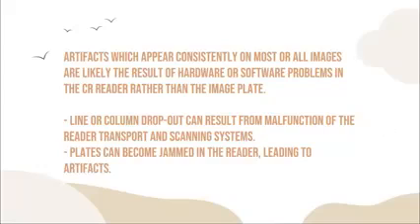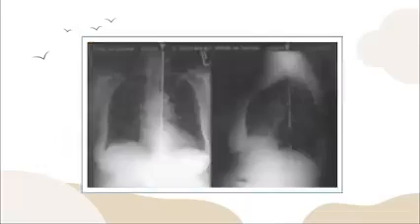Artifacts produced by dust can be corrected easily with proper cleaning unless the dust is internal to the optics of a CR system. Yun, professional help is advised. So, malimpyuhan siya kung sa outer areas. Pero kung naa siya sa mga inner areas sa inyong scanner, okay, professional help should be acquired again. It can be caused by dust on the optic polygonal mirror, optic mirror, or sa fiber optics. Okay, dust on the optics, lenses, and mirrors of a CR processor can cause pixel dropout.